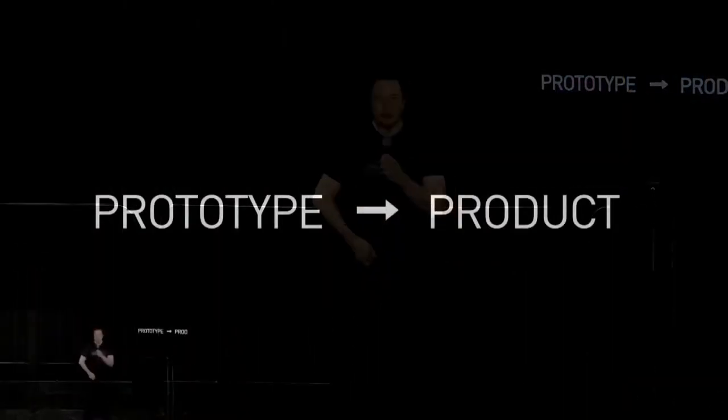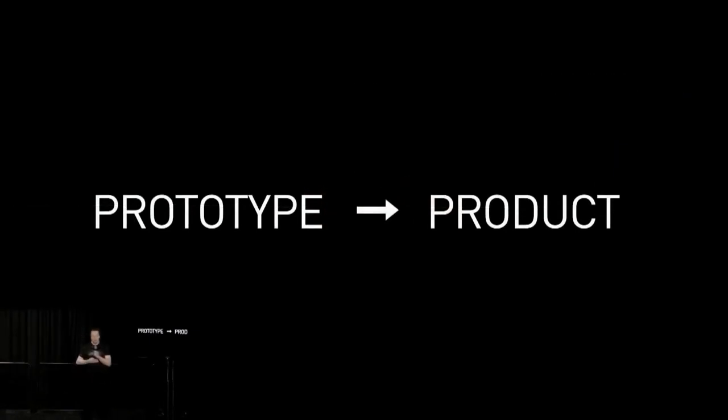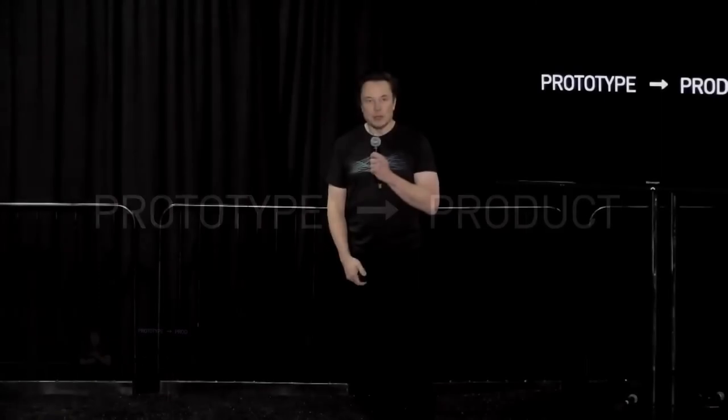So what we've been doing since then is we've been on the very difficult journey from prototype to product, but we've been working hard to be ready for our first human. And obviously we want to be extremely careful and certain that it will work well before putting a device in a human. But we've submitted most of our paperwork to the FDA and in about six months we should be able to have our first Neuralink in a human.